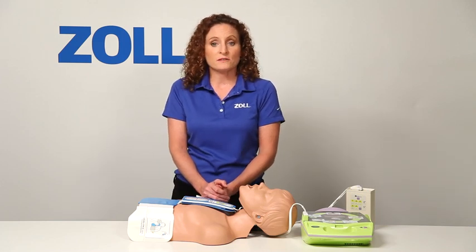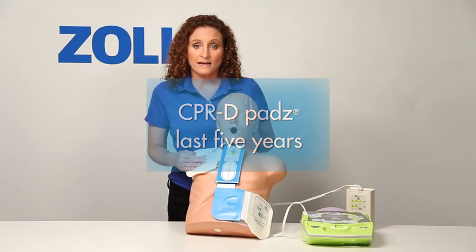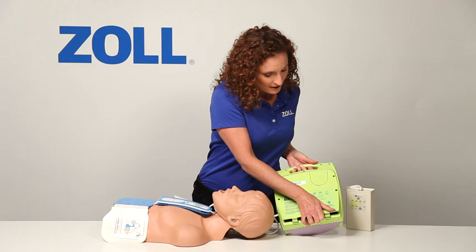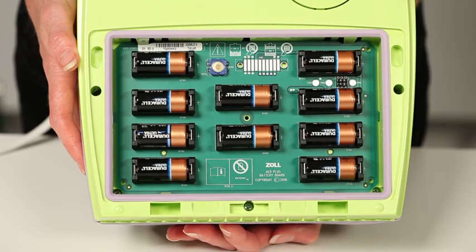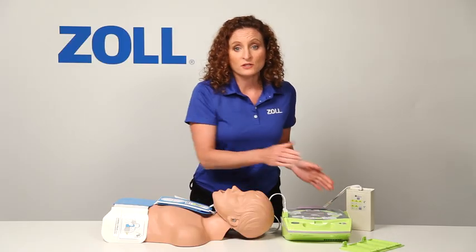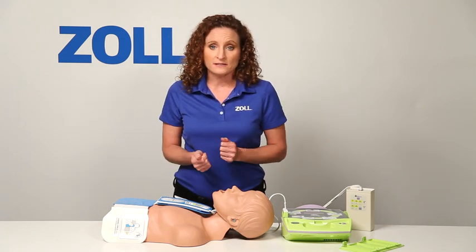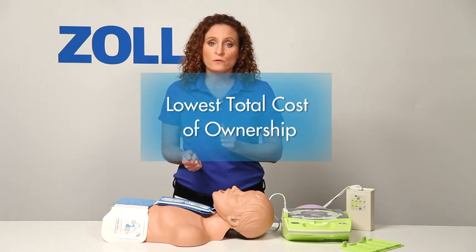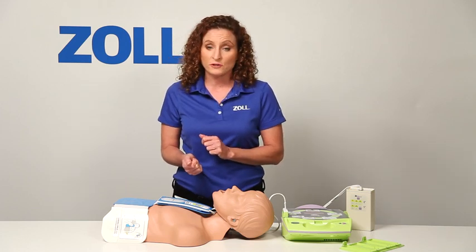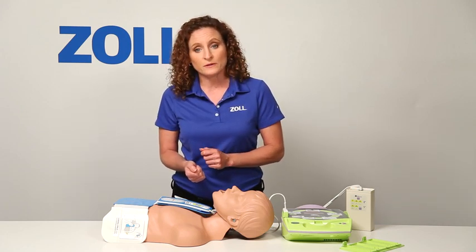Now let me point out a few more details of the AED Plus. The CPR-D pads are specially designed to last for 5 years. And here are the 10 lithium batteries that power this AED — they last 5 years in standby mode. That means when you have installed the AED Plus, in the absence of a clinical event, there is nothing to buy or replace for the next 5 years. The AED Plus has the lowest total cost of ownership once it's installed. Because you have to replace pads and batteries only once in the first 10 years, you will significantly reduce the logistical headache of replacing pads and batteries compared with other AEDs.